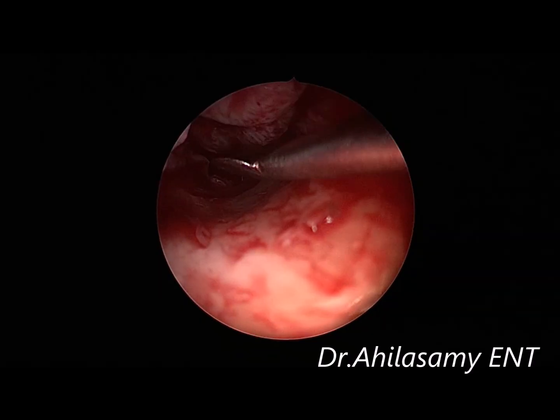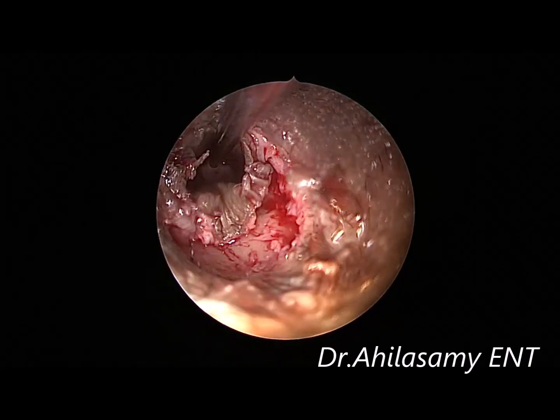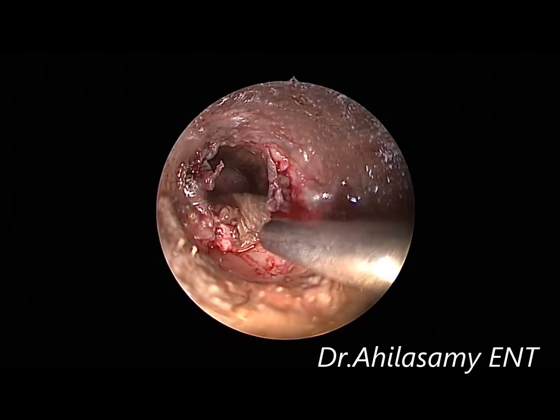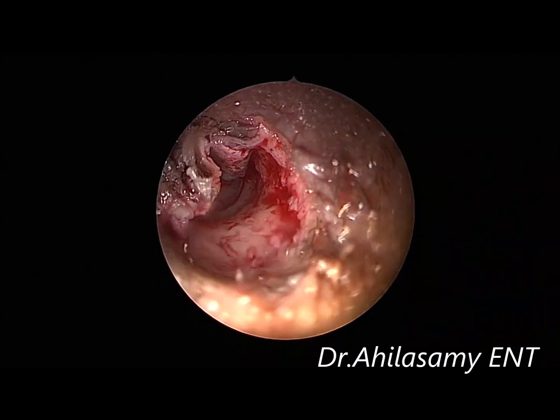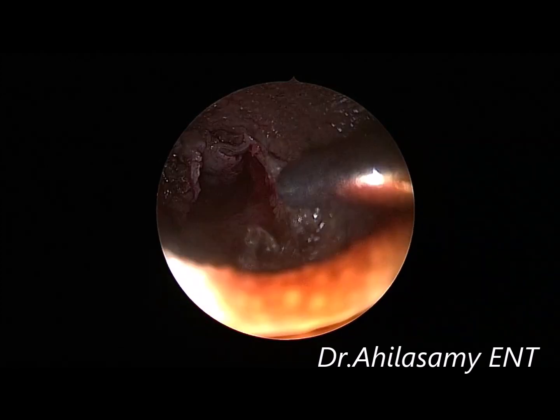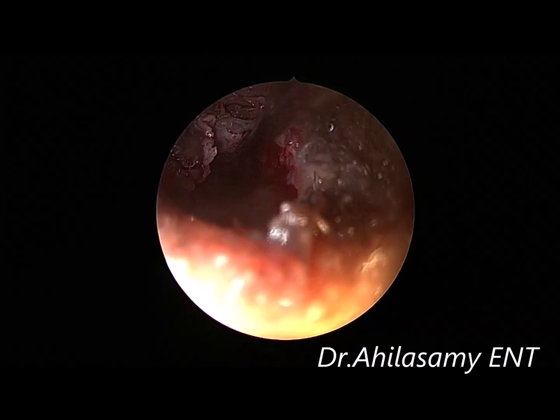Now I am using the plaster knife for the complete elevation, putting the flap aside to see if there is any tear in the flap or not. The cotton ball has been removed.